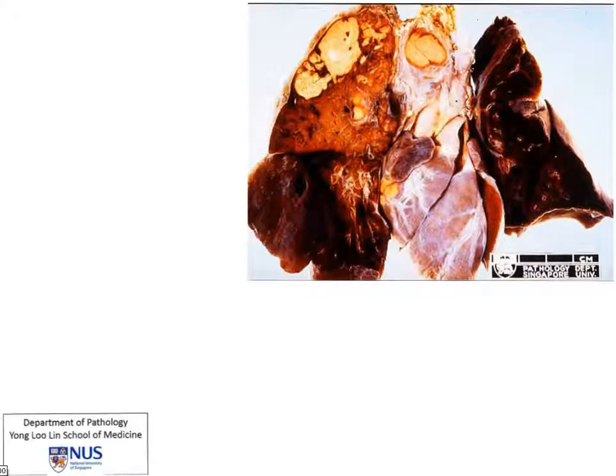Hello, in this picture we can see the right lung, the heart, mediastinal lymph nodes that are abnormal, and the left lung. Now what is very obviously abnormal here is that in the upper lobe of the right lung there is this geographic yellowish area, and we can see another focus here, a little bit of cavity formation here, and we see that the same process is present in the abnormal mediastinal lymph nodes.